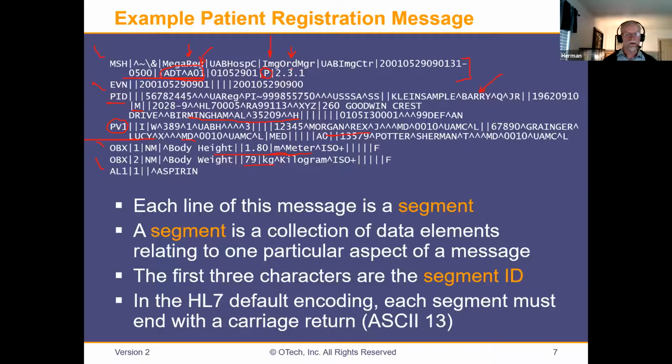I don't need to look for this particular patient. So simple. And by the way, the encoding itself, right? Every component has a fixed location in the HL7 message. It's like a form in a fixed location. For example, the patient name, Barry, is always at the 1, 2, 3, 4, 5th location. And the location is identified with these pipes, with these bars. So you count the bars.